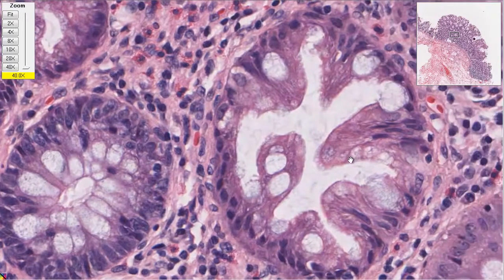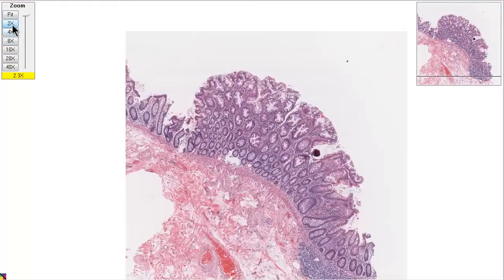This one here looks different, and what it is, it's piled up. It's a little bit bigger around, because there are more cells. They're all piled up and going like this, and they even branch. So we look a little more closely at this piece, and we say, I wonder if that's cancer. Could it be precancer, or is this just an area of irritation?